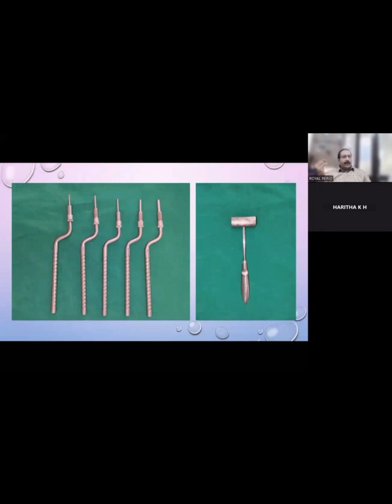Still you can place an implant of 4.25, but it's better that you stop with the previous one, the third osteotome, finish off the raising, and go for placement of the implant. So with that 3.2, you need to place a 4.25 implant. So 8 or 10 is the question mark. We'll fix it as 8. If everything works out well, 10 is also possible.